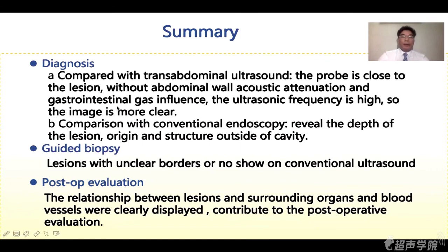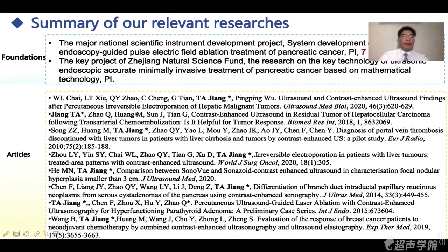So we summarize the advantages of CHEUS as mainly 3 aspects. 1 is diagnosis, 2 is guided biopsy, 3 is post-op evaluation. This is a summary of our relevant research. These are foundations and articles.